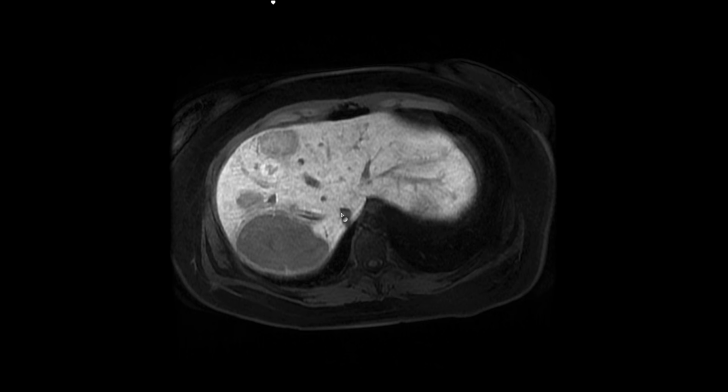We'll talk about the specifics later. Again, future videos are going to look at characterizing liver lesions. We'll have a liver MRI video. We'll also put out a pelvic MRI and a prostate MRI video as well to help you approach those studies.